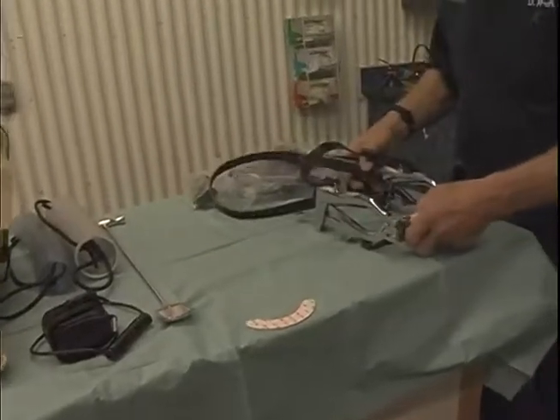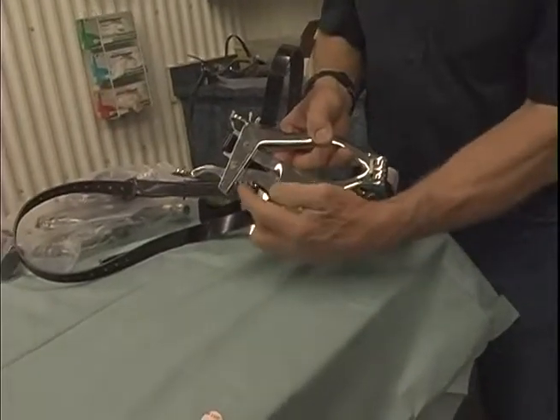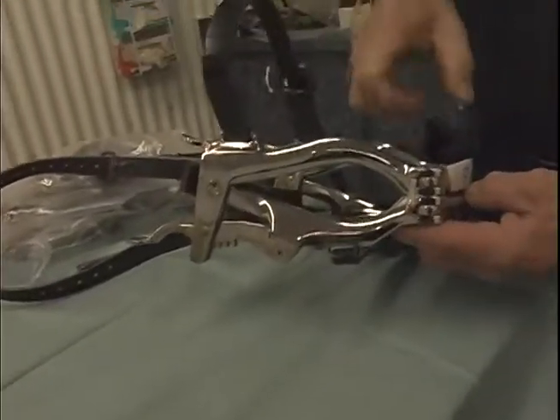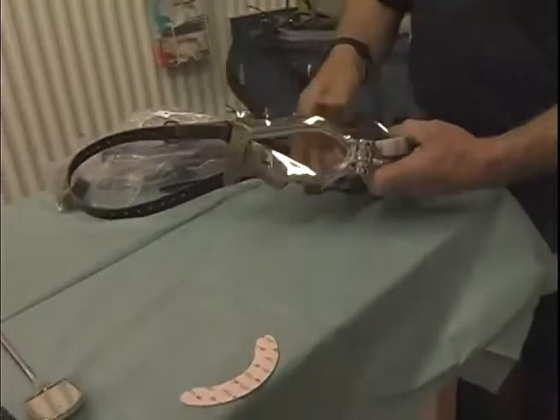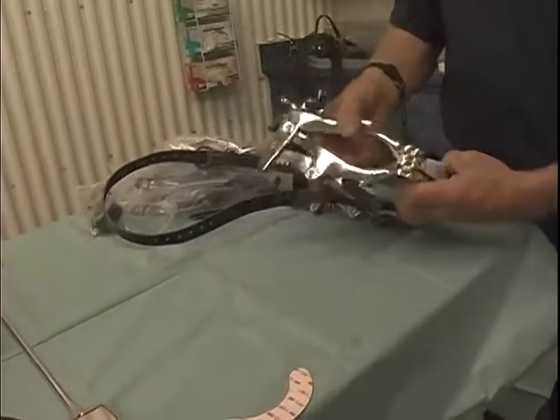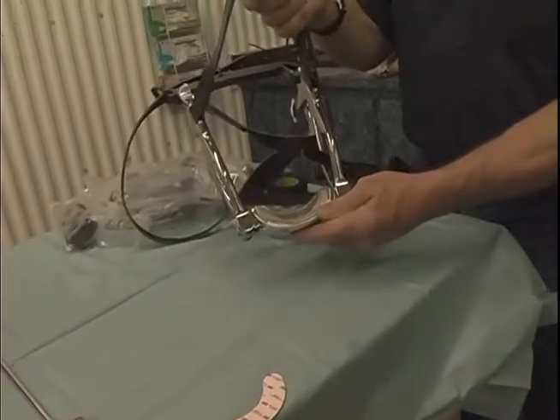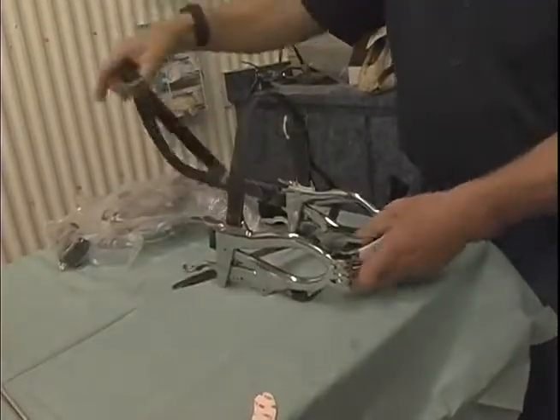The other speculum carried by PowerFloat has special features, which are the notches on the side. In most McPherson or Houseman speculums, there are 3 notches to open the incisor plates to an opening distance of 9 centimeters. This one has been modified so that it's on the 5th notch so that it's open. This makes this speculum easier to open. It is a fairly wide entry into the side of the mouth. The incisor plates are somewhat smaller, like most Houseman speculums, but it's a very good speculum and it's light.